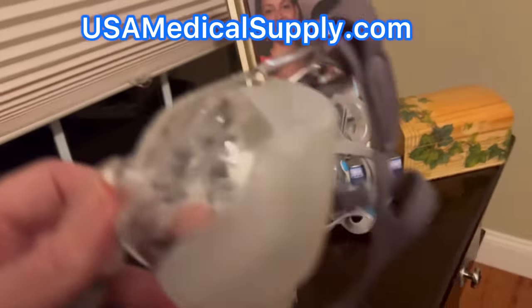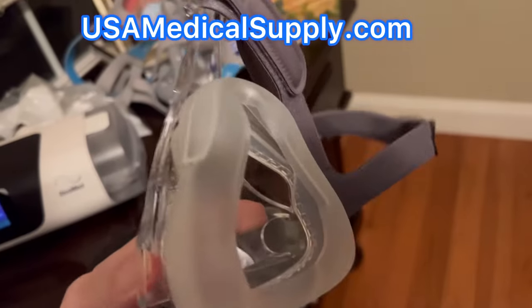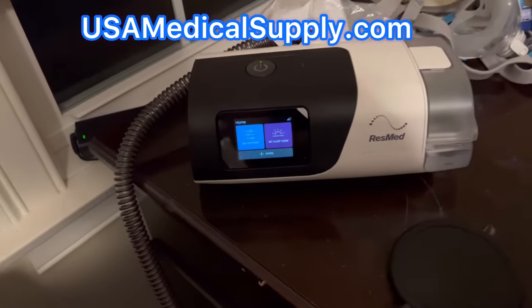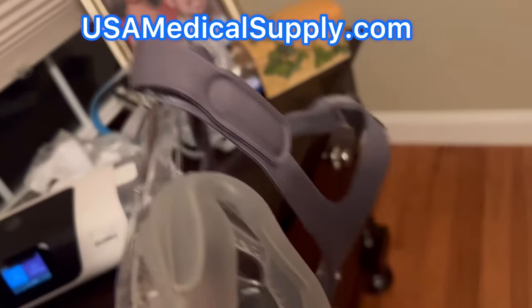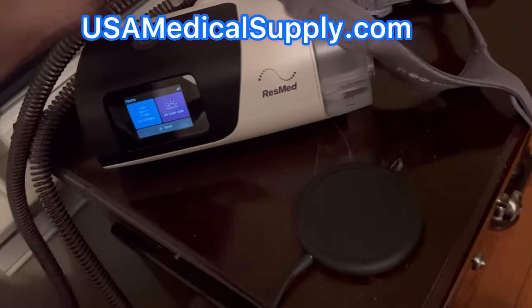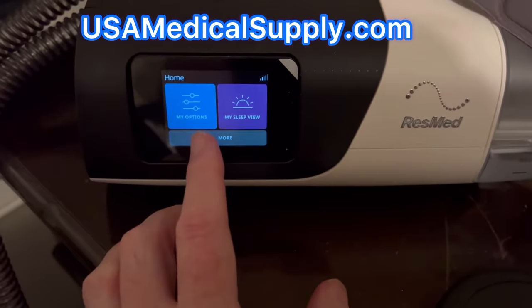If you're like me where you start off at a smaller ramp pressure of around four, you get a great seal as you're starting to fall asleep. But when those pressures go up, you start to get a leak in the middle of the night where you're adjusting those head straps. MaskFit is definitely for you because you can make those adjustments at higher pressures before you go to bed.